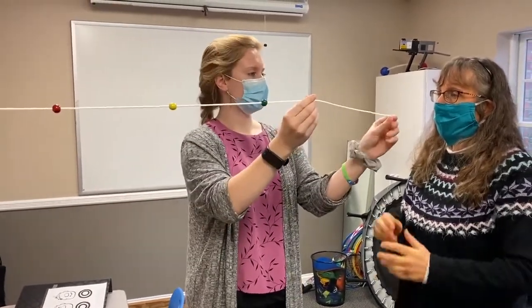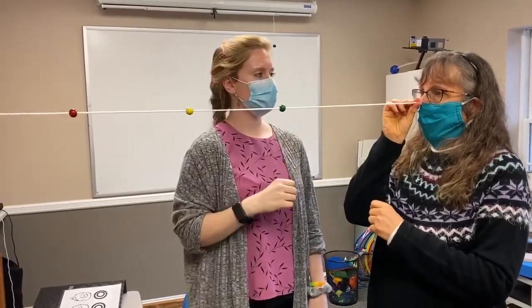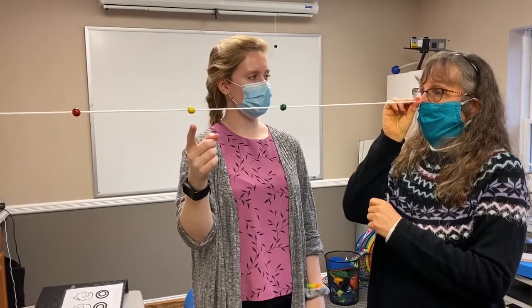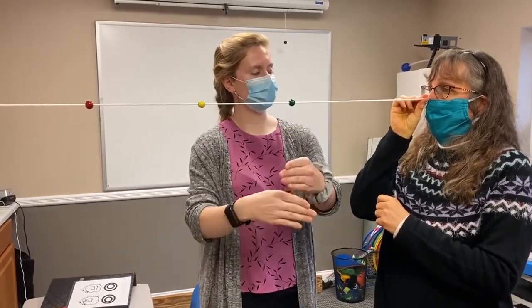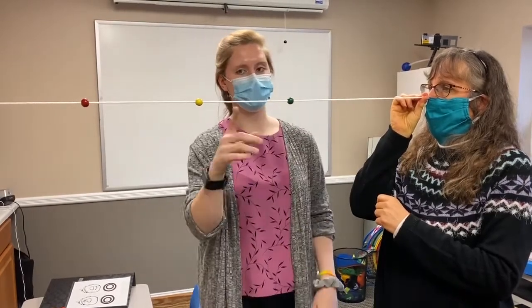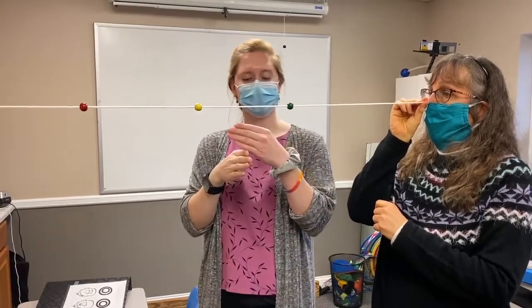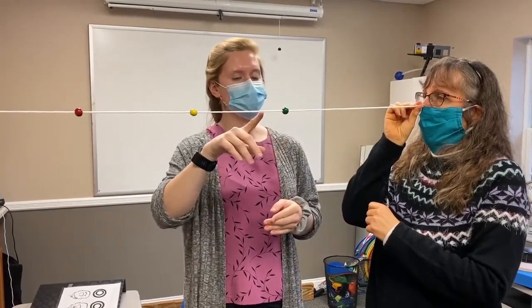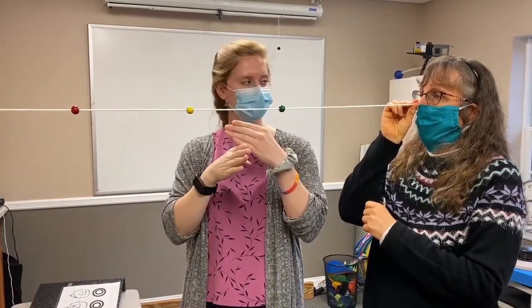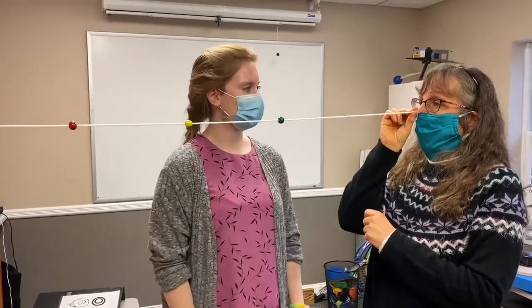Over time, you can switch between looking at the green bead, then the yellow bead, then the red bead, and you can see how the strings cross as you move out and the beads start to double. Eventually you can jump from bead to bead, and even do what we call 'bug on a string' — where you imagine the bead moving, take that X and move it along the string, then move it back.